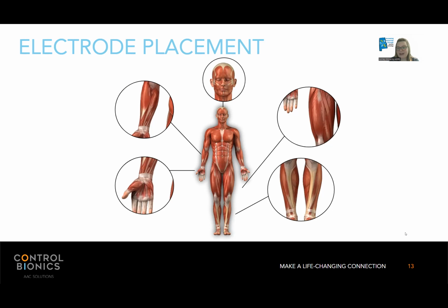Always technical difficulties. So I just want to clarify what the NeuroNode is exactly. Typically in the augmentative communication device world, speech therapy, we deal a lot with external switches, ability switches. We just typically call them switches. And that is basically a button. It's usually a button that the user can activate to allow a signal, just like a button on your keyboard or something of that nature. And there's a variety of different kinds of switches out there in the world.